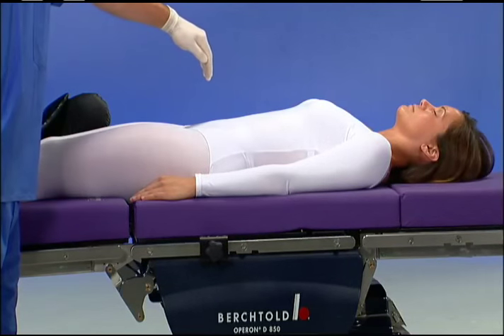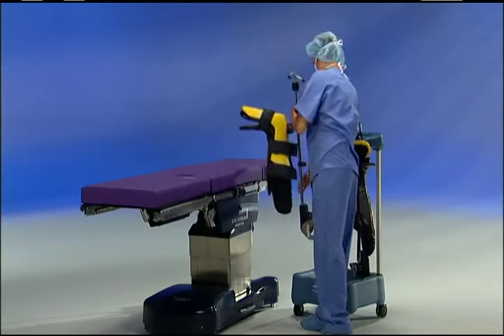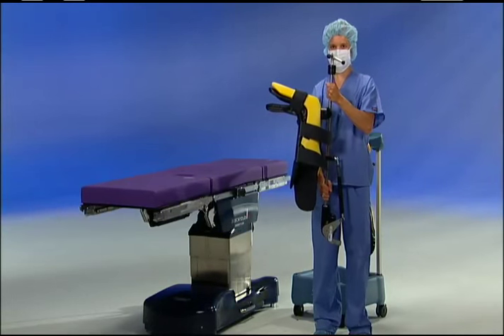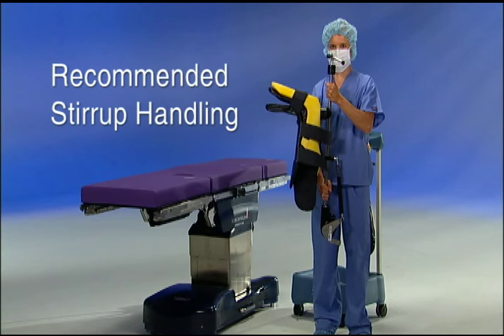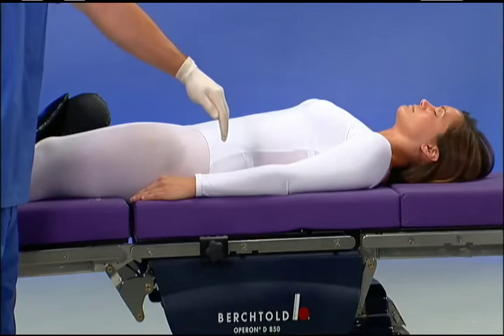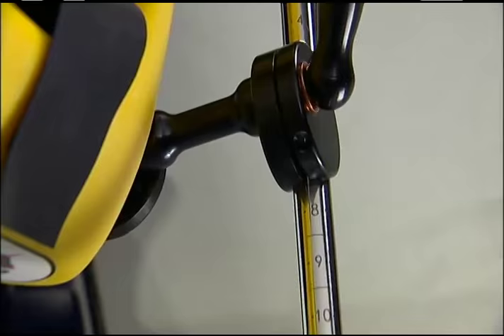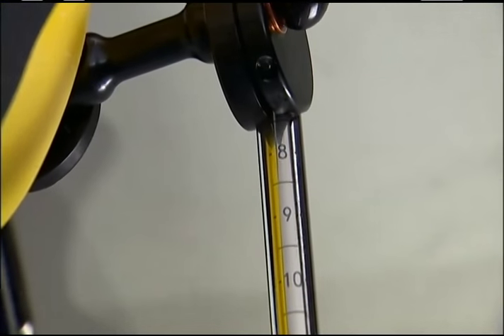Locate the position of the patient's hip and attach the clamp to the rail adjacent to the patient's hip. When holding or carrying stirrups, never hold them by the lift assist handle. Always hold a stirrup by grasping the rod in two places — this helps prevent injuries to OR staff. Holding the stirrups vertically will minimize stress on your back. Symmetry is very important: make sure the clamps line up on either side of the table and that the rod markings are even, marking the degrees of flexion.